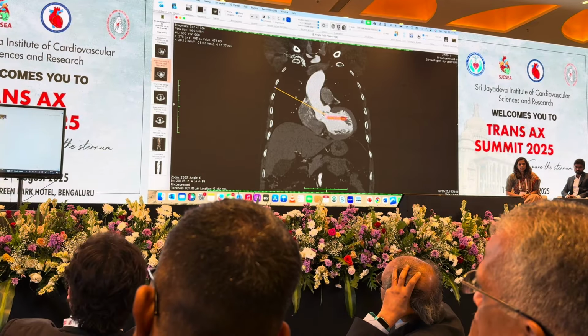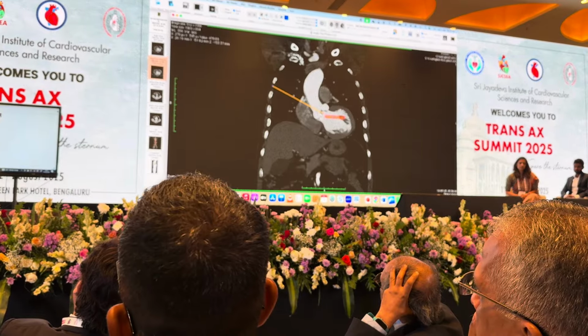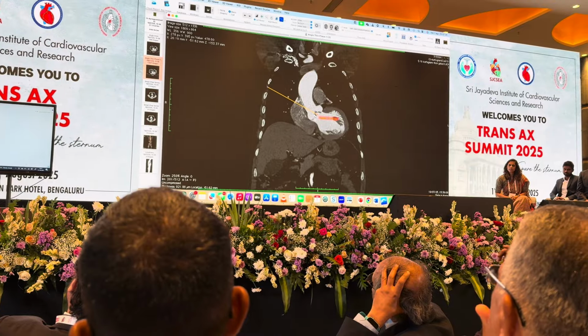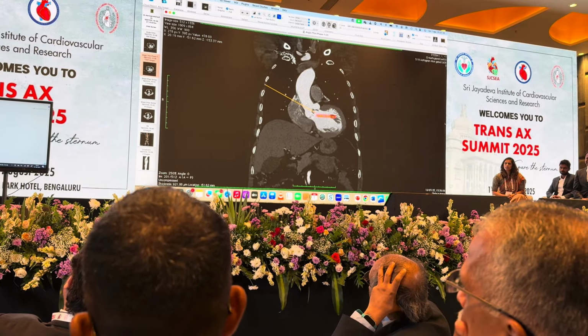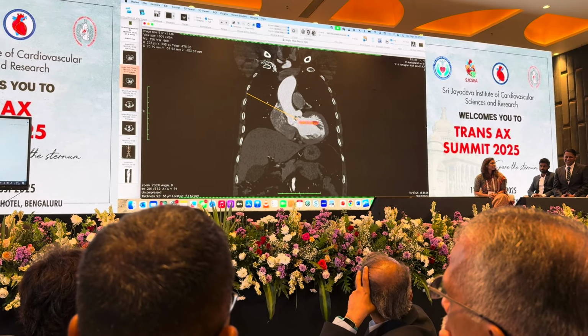When you are below 14, 15, it's going to be easy. You can do even beyond, but I think you have this problem. This valve was at 5 centimeters from the chest wall after we put the sutures. 5 centimeters. I see you can confirm.